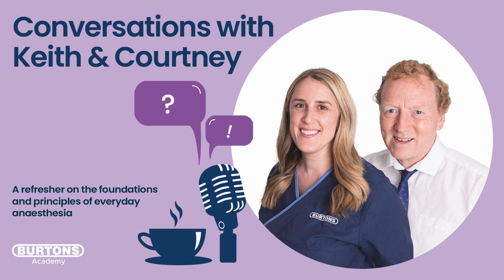So now we've got the tools, haven't we? We know how to go up and connect the machine to the patient and set those values, and then start ventilating. And we could simply do that. And if our respiratory rate is sufficiently above the patient's spontaneous rate, you'll find that the breaths that fall in between the patient's spontaneous breathing are sufficient to then get rid of CO2 and take over ventilation.